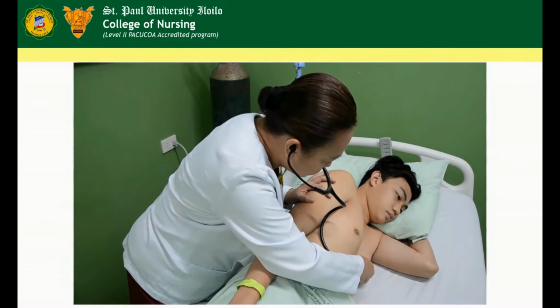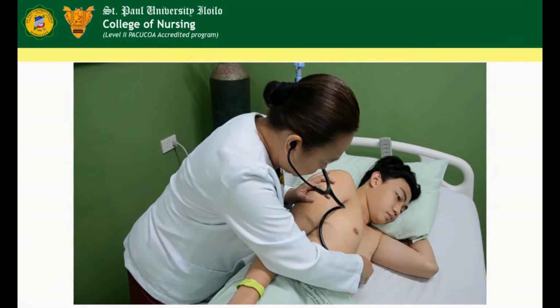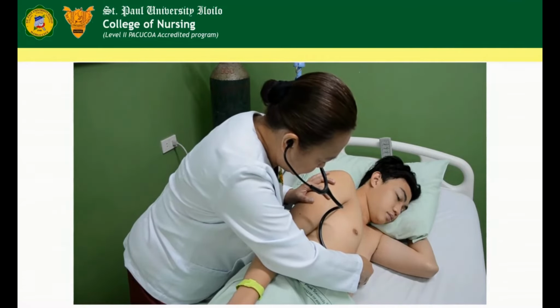Note rate, rhythm, and location. Listen at the apex when at the left side lying with breath held in exhalation. Use firm pressure on the diaphragm and light pressure on the bell.